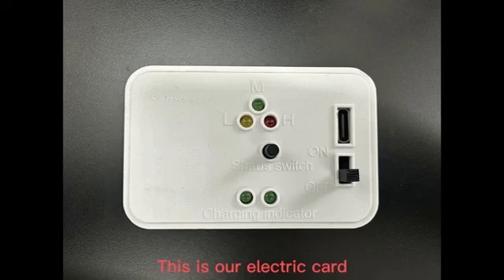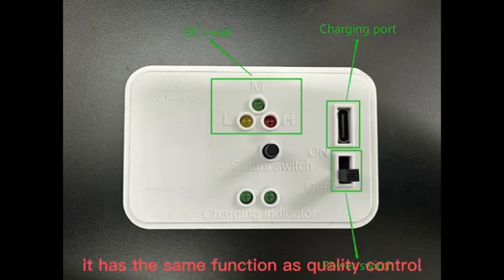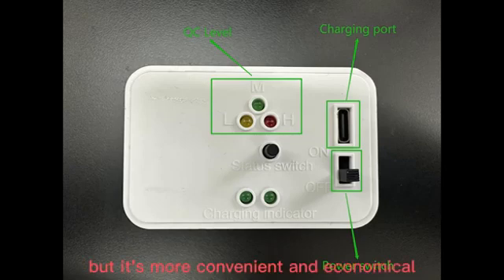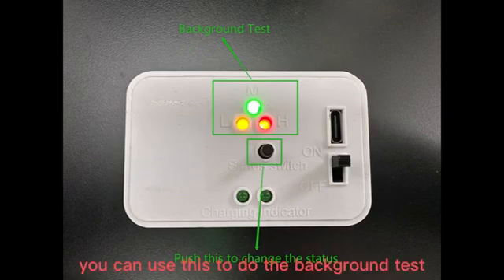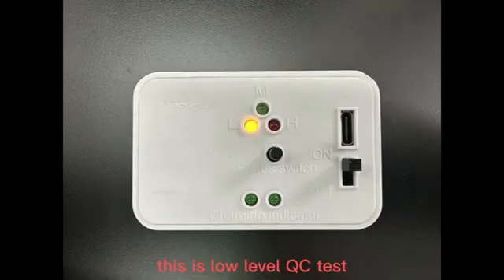This is our electric card. It has the same function as quality control but it's more convenient and economical. Turn on the power switch, click the status switch. When three lights are on, it is in background test mode. You can use this to do the background test. This is the low level QC test.